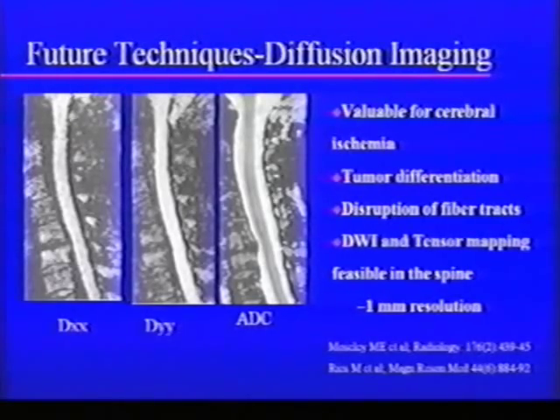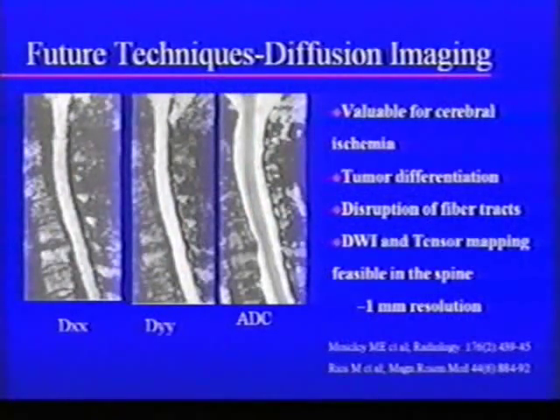So if you got up and decided to leave right now, if you tried to come straight and go over the tables, it would be fairly difficult, and it would be hard. But if you said, I'm just shooting right down the row, I'm out of here, it would be easy. And what these maps are, their intensity brightness is based on how easy it is to travel, okay? So it should make sense here.